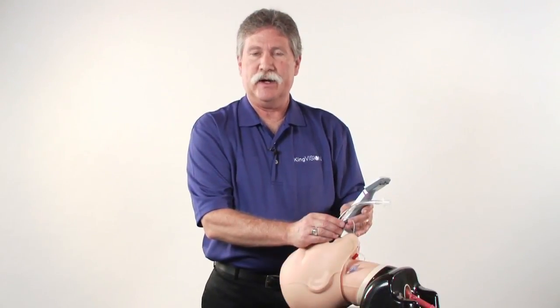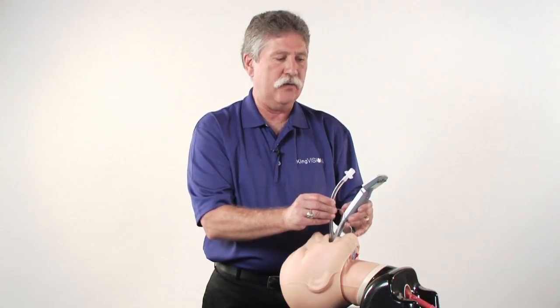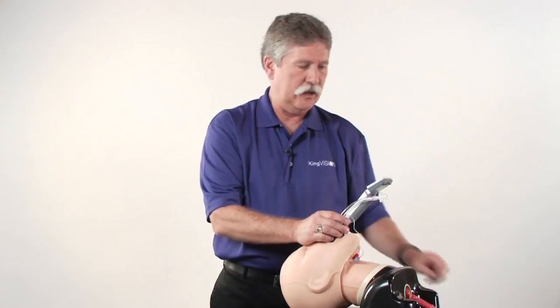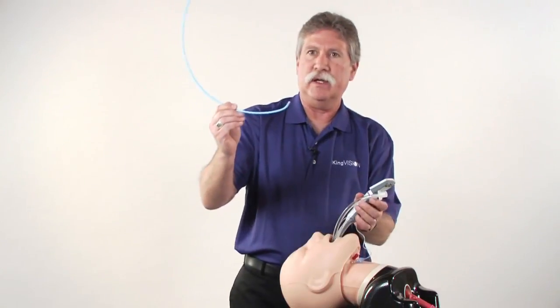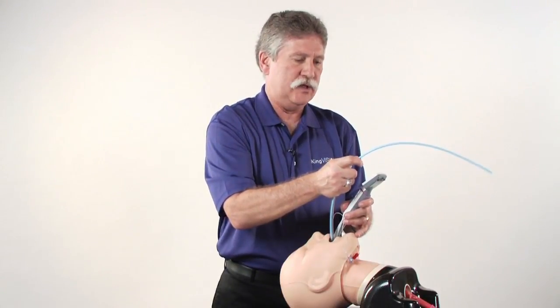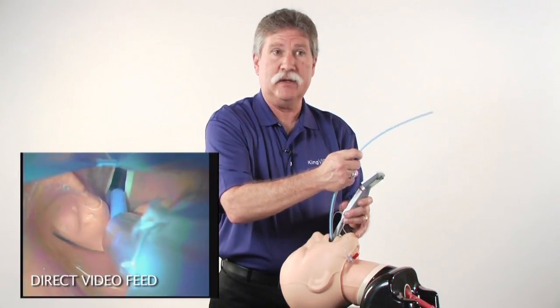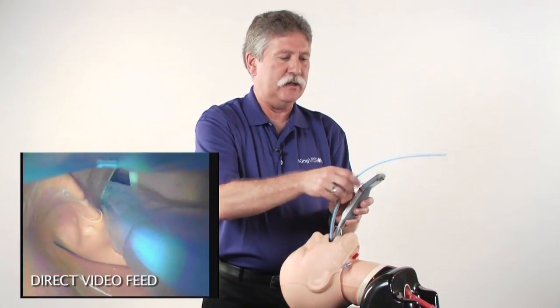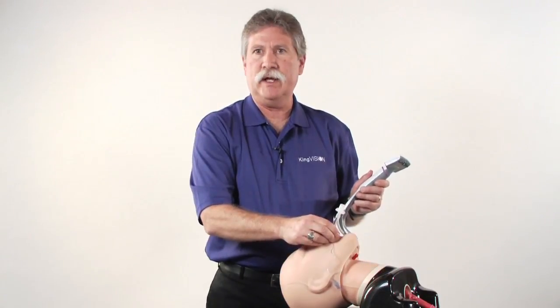For an extremely anterior larynx, there's another technique that can be used if, for whatever reason — lifting or manipulating with the tube — you just can't get the tube to enter the laryngeal inlet and need a little more anterior deflection. You can use a bougie with the coudé tip angled anteriorly within the tube, positioning the tube right under the opening to the larynx, using that angulated tip to advance the bougie through the vocal cords into the trachea, then advancing the tube while watching to make sure it goes into the trachea, withdrawing the bougie and removing the blade in the normal manner.